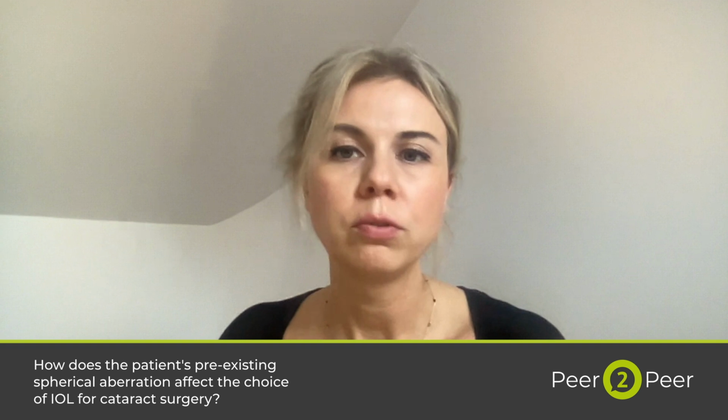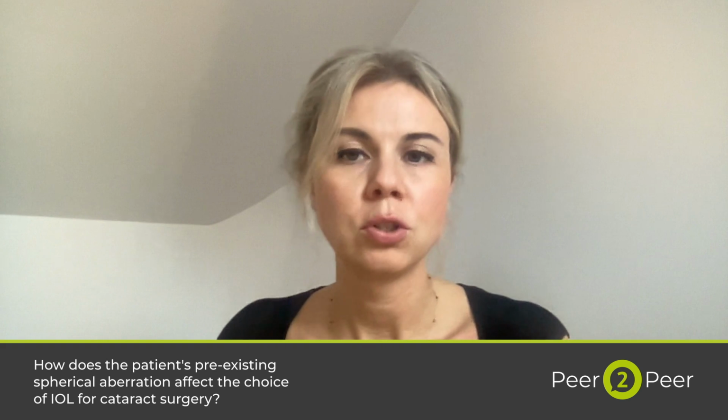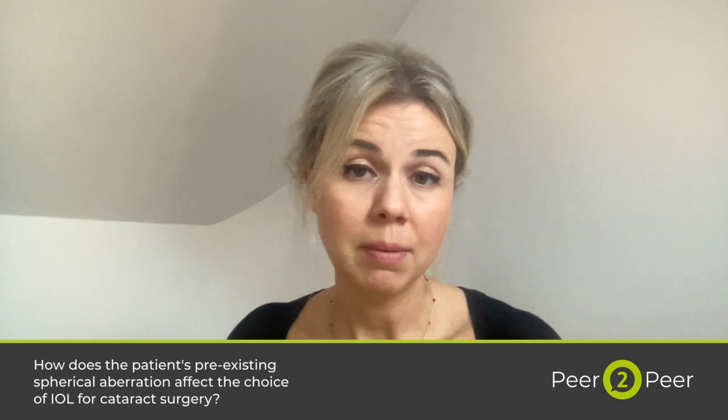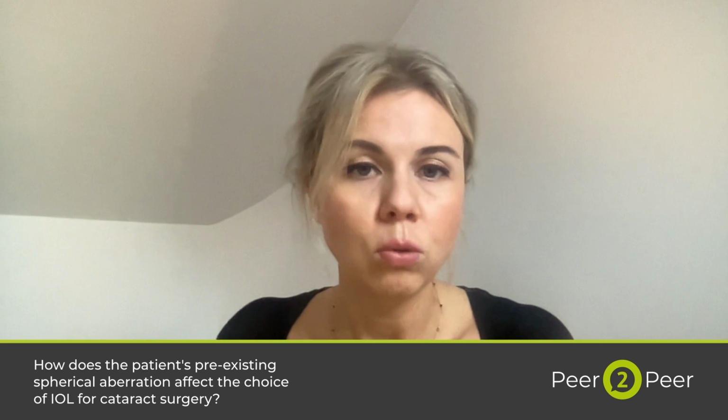When we have a patient with no history of refractive surgery and naturally positive spherical aberration of the cornea, I think the best option is to implant either an aspheric IOL with small positive spherical aberration like EMV, or an aberration neutral aspheric IOL, for example RayOne aspheric. After myopic LASIK, it depends on the amount of spherical aberration. If it is high, I would choose an aberration neutral IOL. If low, a small positive spherical aberration IOL to increase the depth of focus.